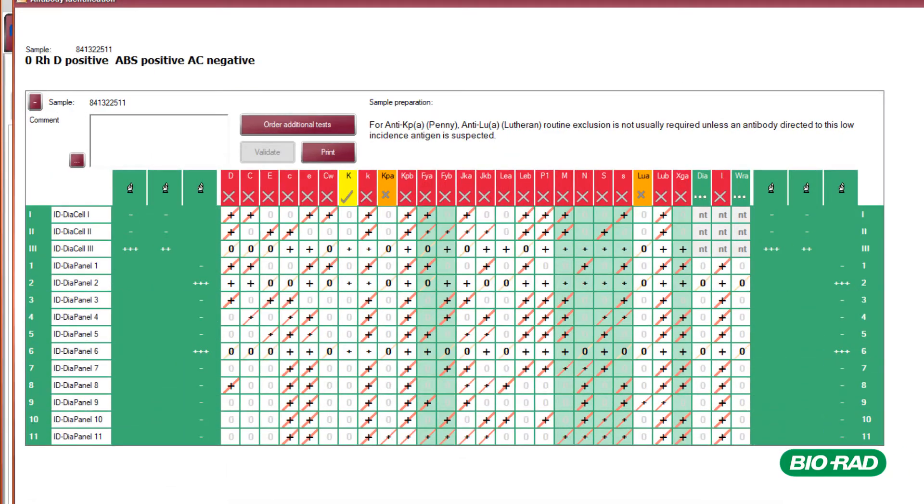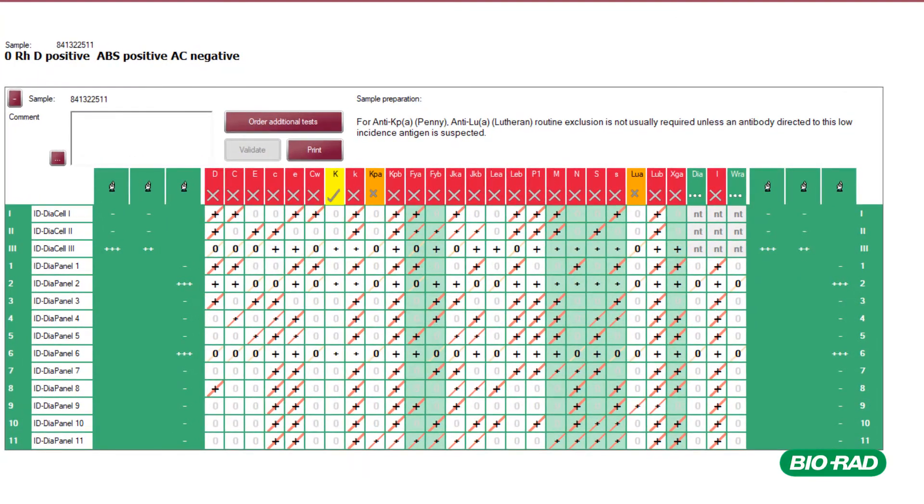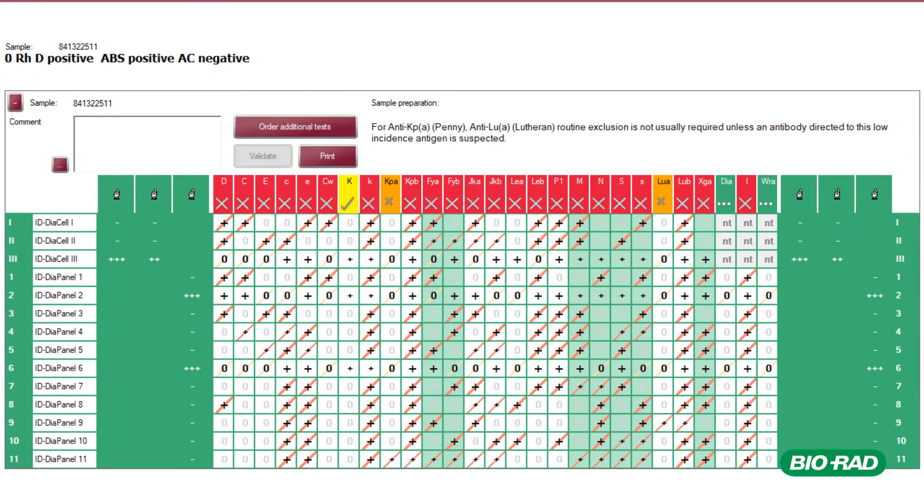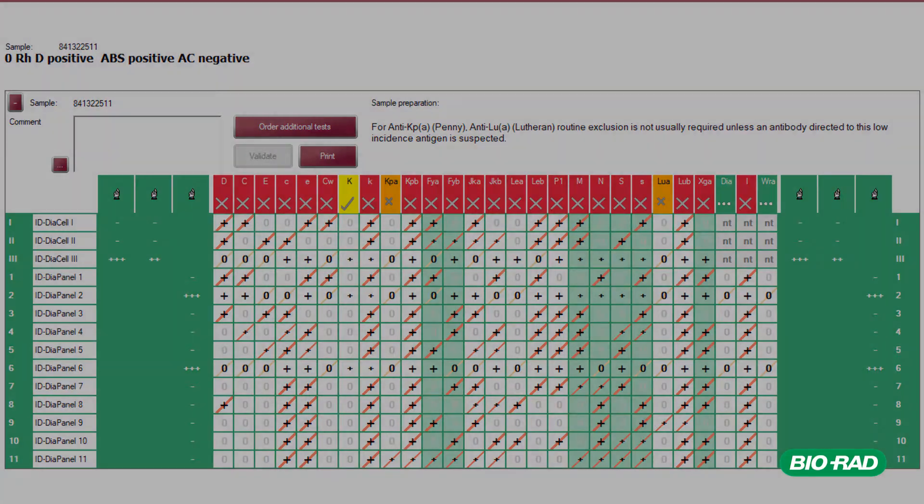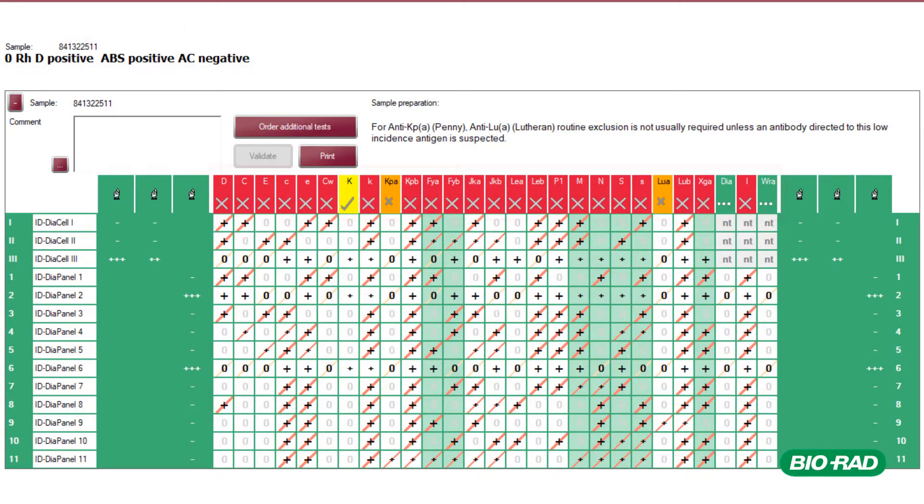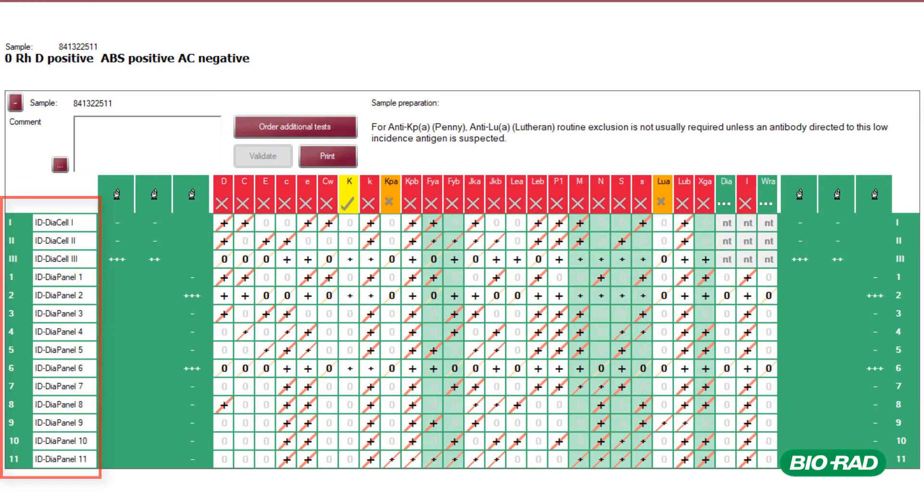The software will produce a digital antigen table. The information contained on the digital antigen table includes patient details including grouping details and sample number, antigens tested, reagent red cells tested. In this example, the 3-cell screen has automatically been included in the analysis.